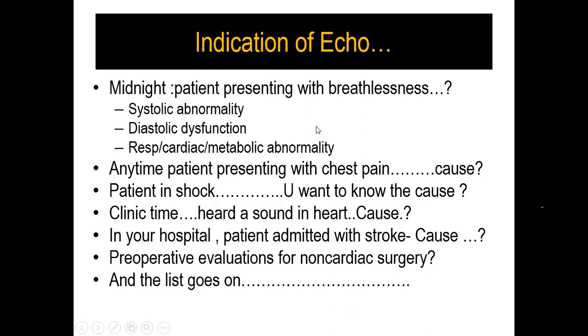Who can give you all these answers? Echocardiography, along with other modalities. All of us who work in tertiary care hospitals understand that whenever a person comes with breathlessness, we have SOB protocols, and echo is one of them along with other things. Patient presenting with chest pain, ambiguous ECGs, possibly echo. Patient in shock, you want to know whether it's hypovolemic, euvolemic, or overloaded, and whether IVC plethora is present.